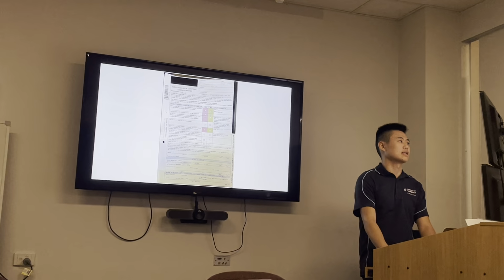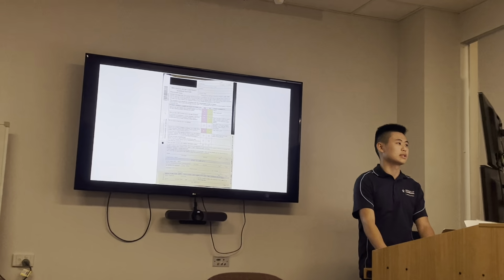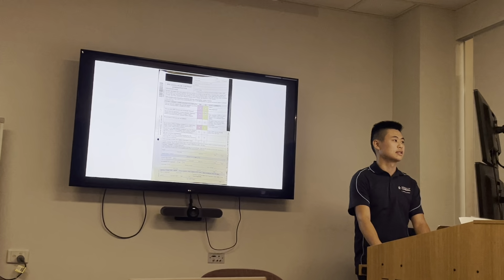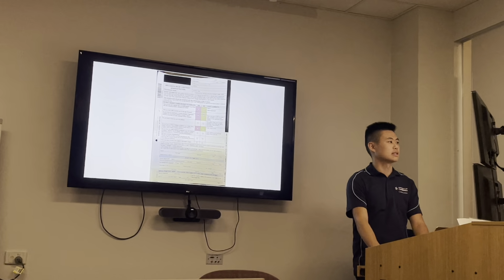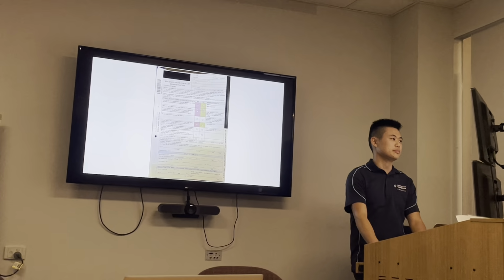So this is the gadolinium contrast administration sheet. Basically, they would have to go through this again with the staff or doctor or nurse, in this case because she's not responsive. And you'd also consult with the family for previous history.